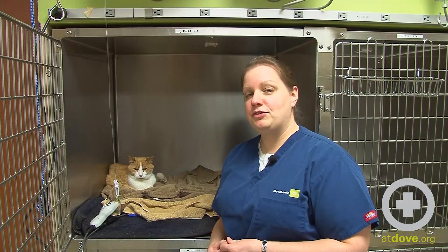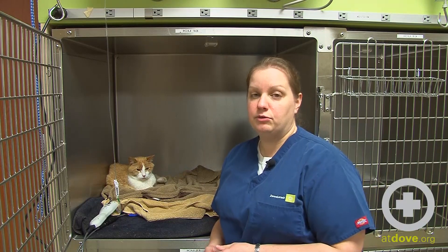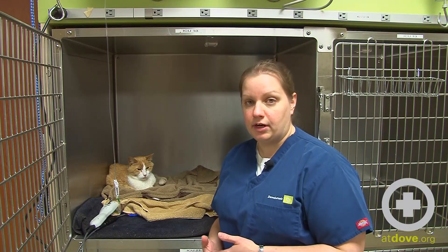Hi, I'm Megan. Today we're going to talk about patient warming. There are a number of different reasons that you can have a patient who is cold, and there are also a lot of different ways that you can rewarm or try to keep your patient warm while they're hospitalized.